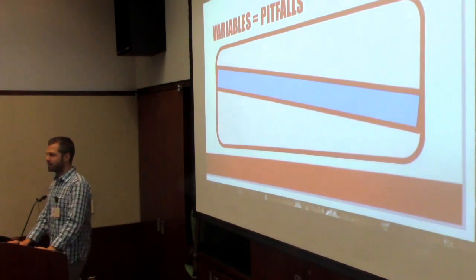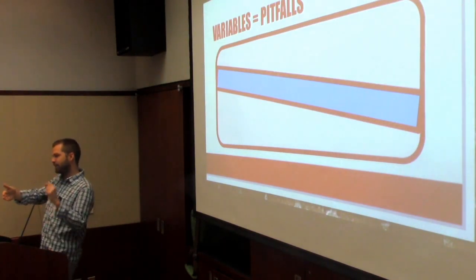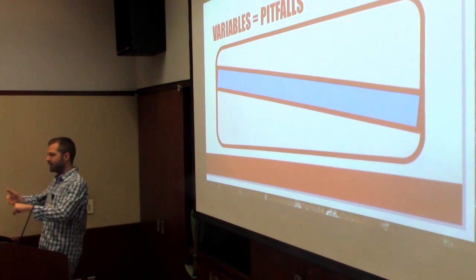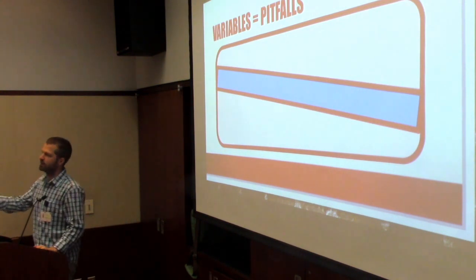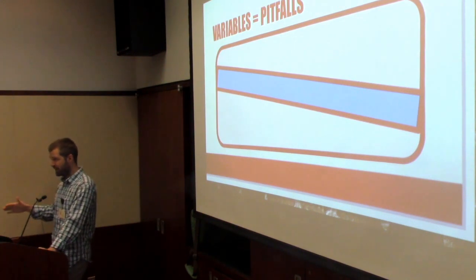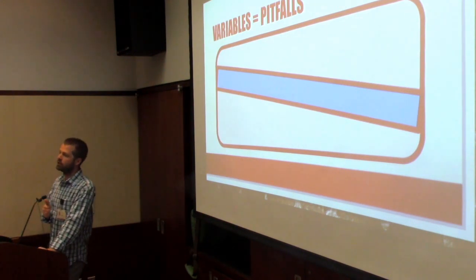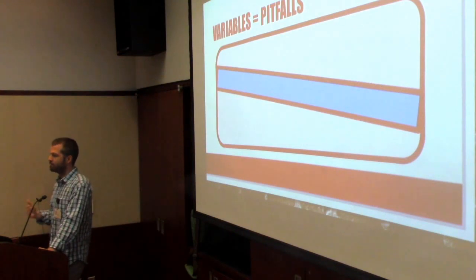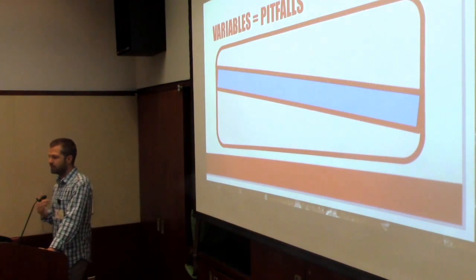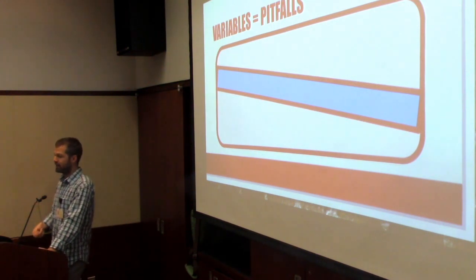Things dive. So people do a cross section, they see a beautiful target, they get way too close to the probe, they stick the needle in, and they're always sort of chasing this down diving vessel. So if it's diving, know that it's diving, start somewhere very, very shallow so that you're likely to get a portion of the vessel you can actually hit. While these diving vessels are really annoying for a lot of vascular access, if you get it at a shallow point, it's actually nice.